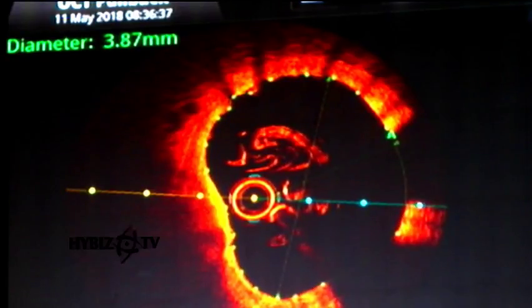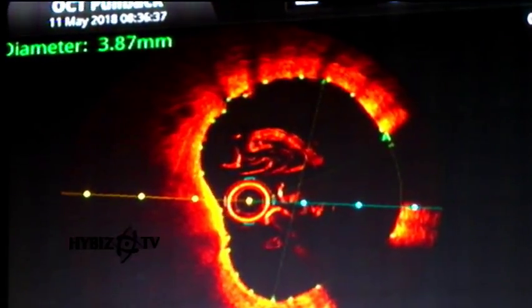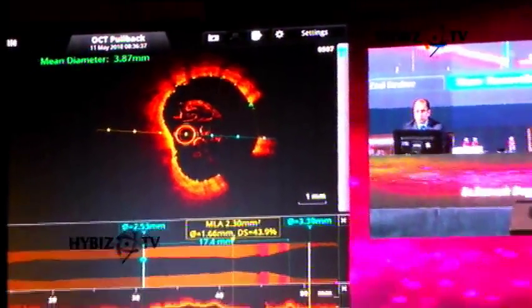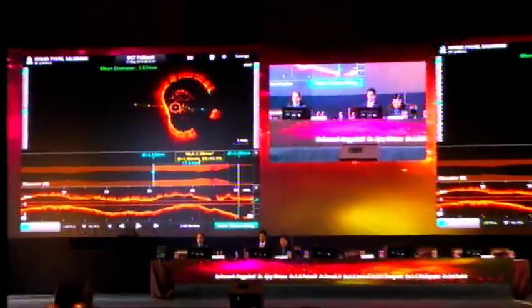I agree, but there is some discussion on how to decide the stent size, media to media or lumen. We always add a quarter size bigger than the lumen area, so it's very similar to media to media, right? Still, there is some discussion about how to decide the stent size. If lumen to lumen is 3.87, media to media will be more. So what is the size you think we should take? Ajay, what do you think we should take?